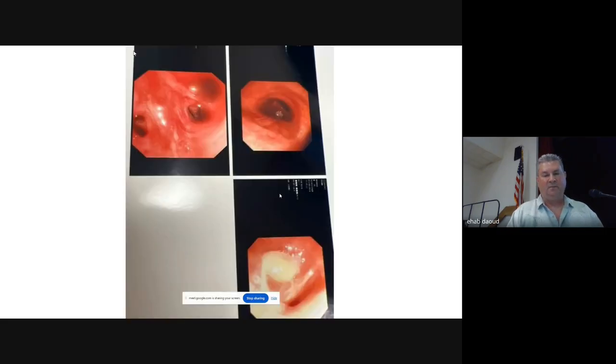So that one, the teeth are hard, right? Because they're really smooth, and it's hard to grab them. It'll just keep slipping off. Cryo doesn't stick to it that well. And so what we did was turn it upside down where the roots are and grab a root and then pull it out.